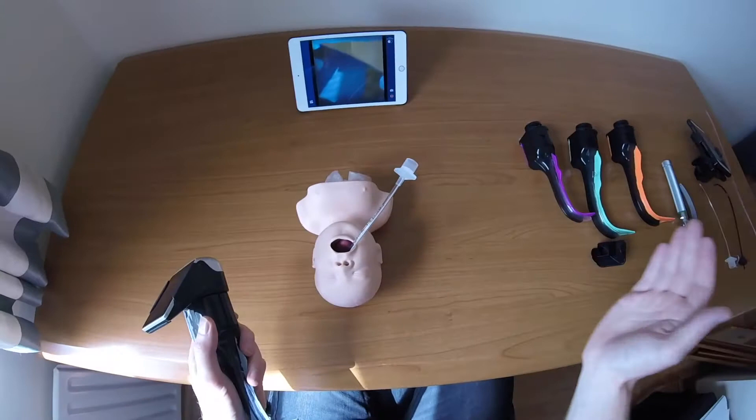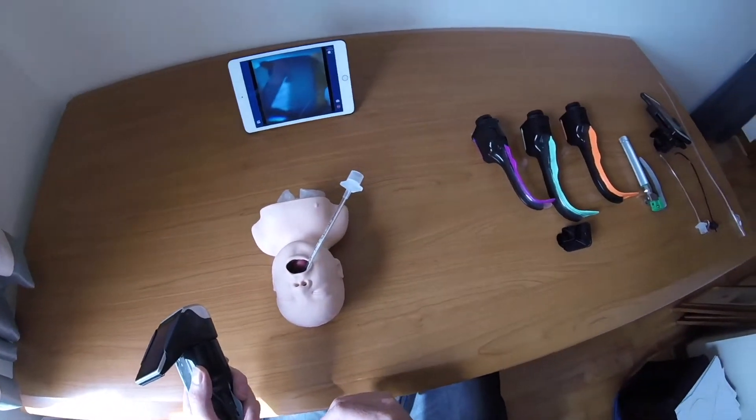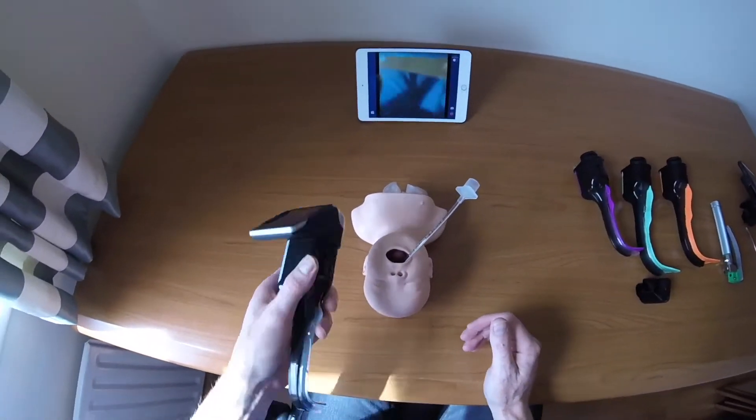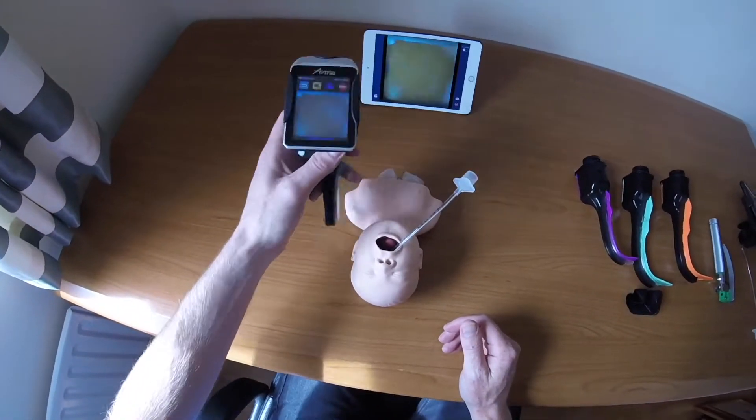Out of all the viewing options, the iPhone camera gives much better resolution than the other solutions. Although the wifi camera is nice to have mirrored on a big screen, it is also very light and well balanced for use.